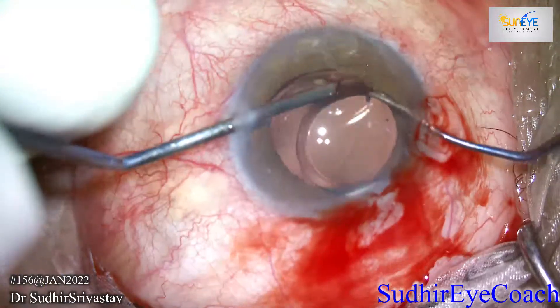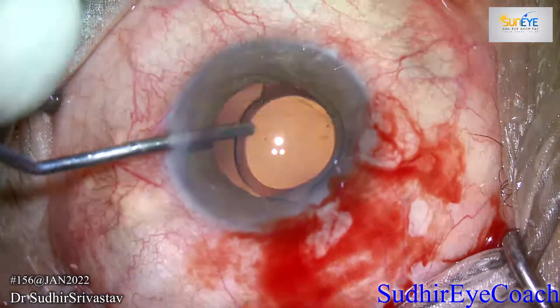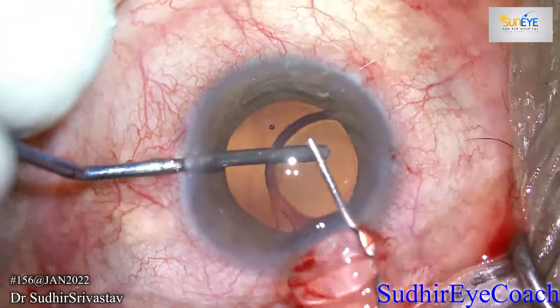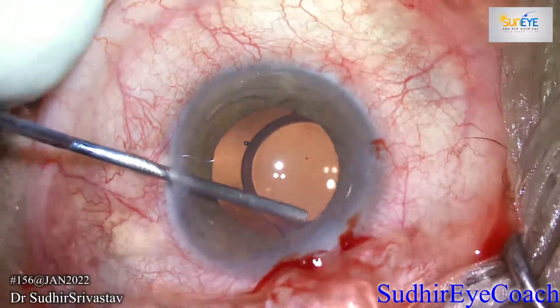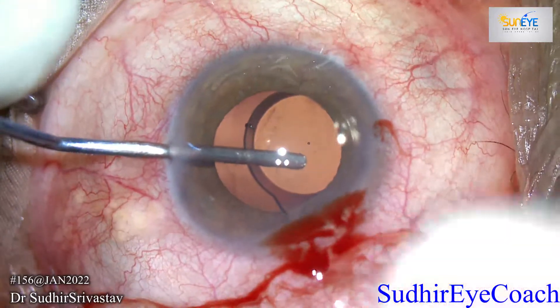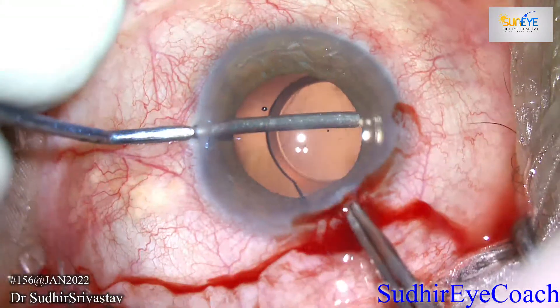I placed it in the anterior chamber. Here I decided not to cut it, but to fold it inside the anterior chamber and remove it through the 3.2 millimeter incision. Whatever you are doing, you have to be careful about two important surfaces: the corneal endothelium and the posterior capsule.